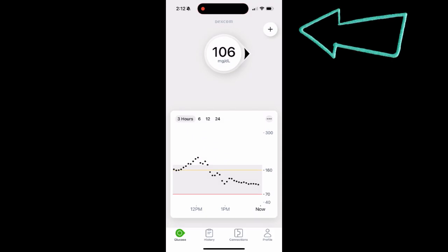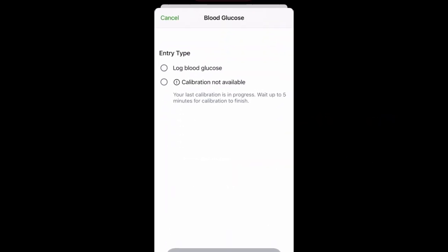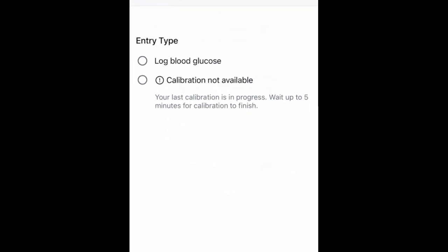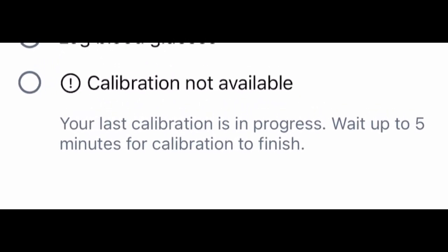It won't allow you to do another calibration for a little while, so try and go in again, and here you can see, it has to be another 5 minutes before you can lock another calibration. But this is how you do that. The value won't jump to the calibrated level right away, it will adjust slowly. I know some people do 2 calibrations fairly close to each other to force the sensor to the calibrated level a little faster. I'll usually only do 1 calibration and wait it out, and usually that works. So calibrations generally work really well for me.